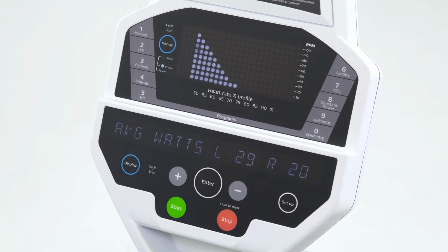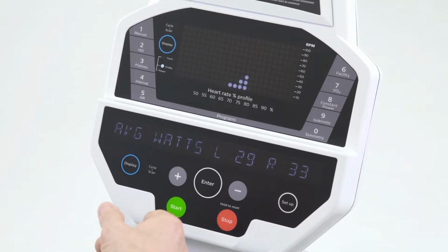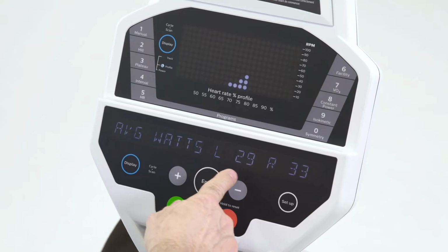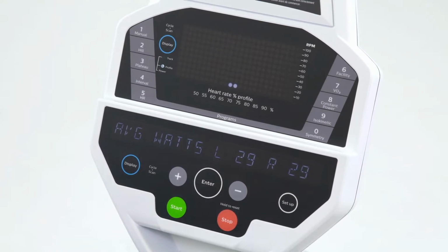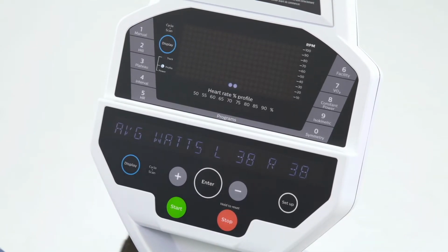So if I increase watts on one side, I'll be able to see that asymmetrical watt measurement, which is not easy to do when you're symmetrical. I am trying to do it, but basically what I would see is my left and right watts here, and I would get a graphical feedback that shows me which side is more powerful on the right or the left.